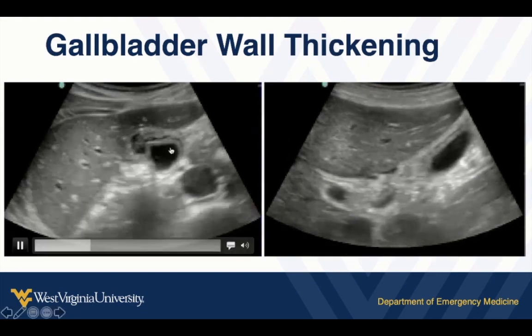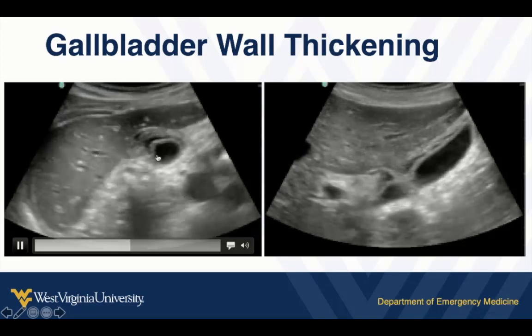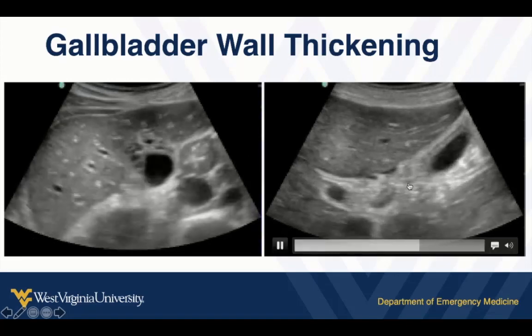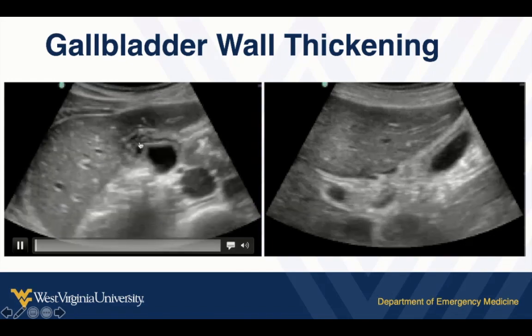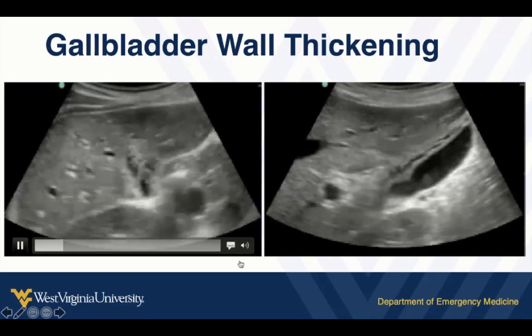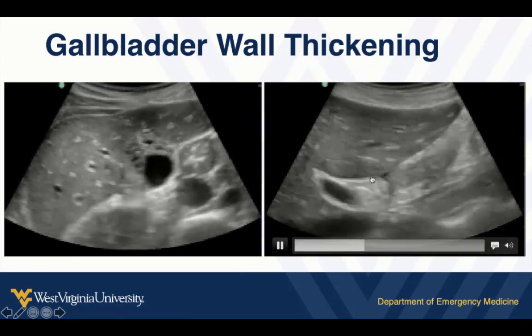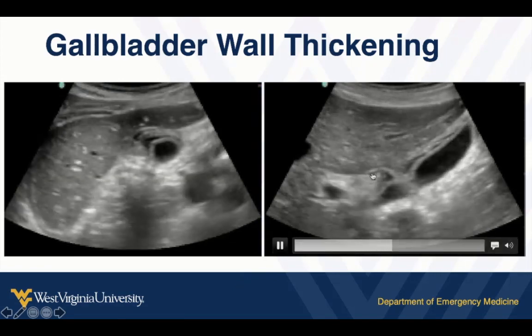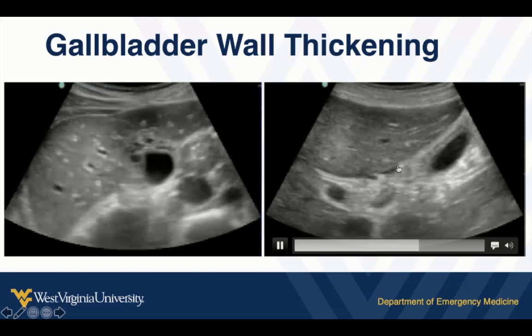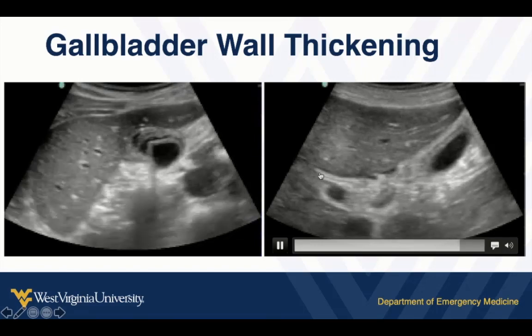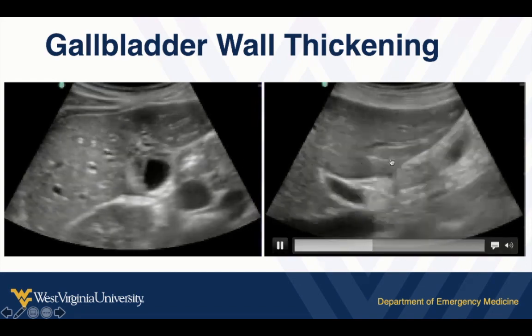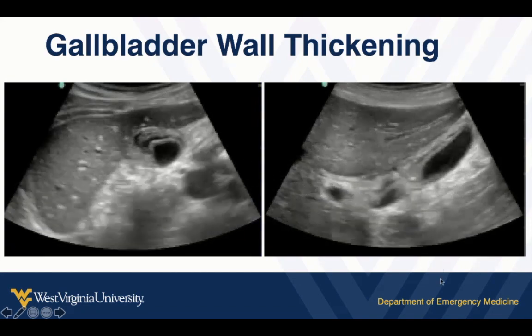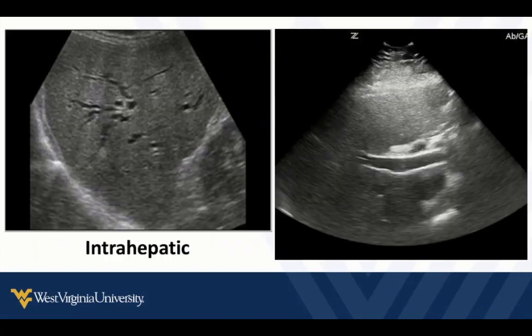We may see thickening and layering of the gallbladder wall. Both of these cases are acalculous. The wall may have a layered appearance, or sometimes it's just thick and ill-defined. In this example, we also see a little pericholecystic fluid layering right along the wall of the gallbladder. These are abnormal gallbladders — in both cases this looks like acalculous cholecystitis.